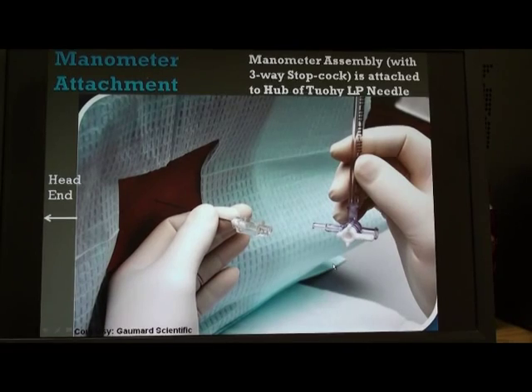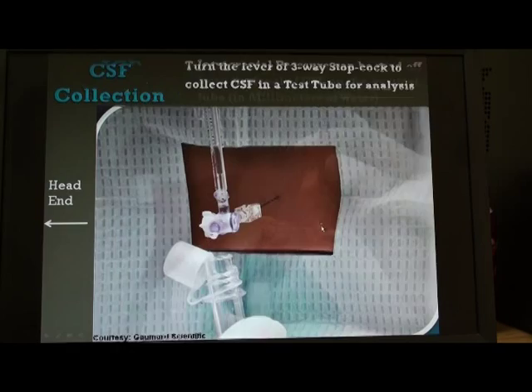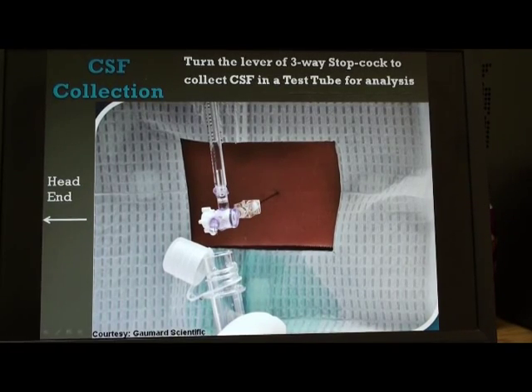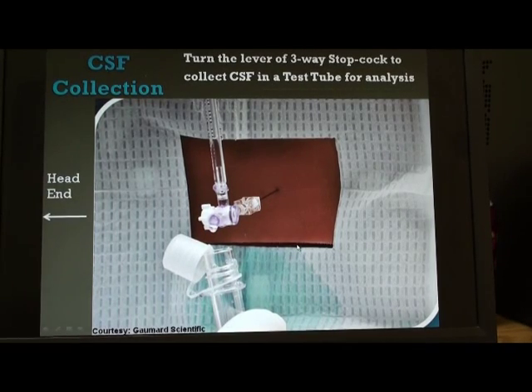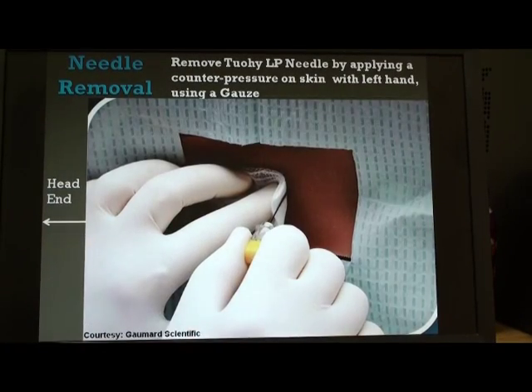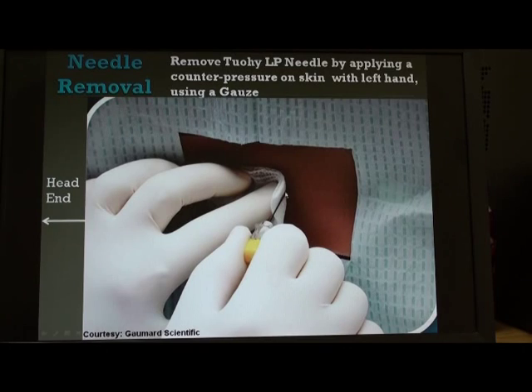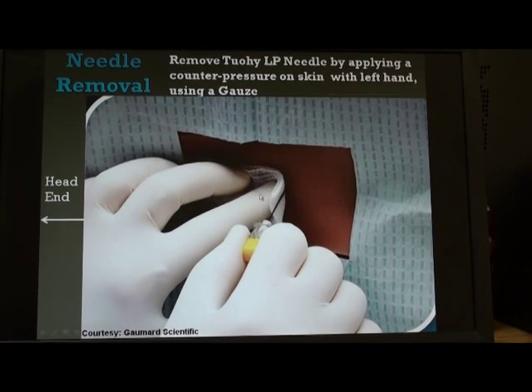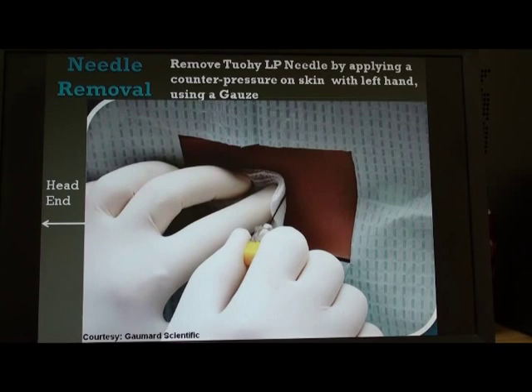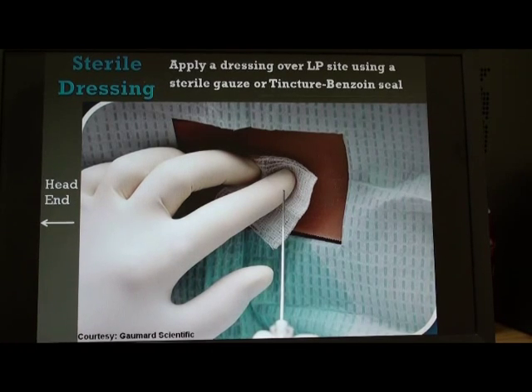Once we have recorded the CSF pressure, the next step is to remove the manometer, turn the three-way stopcock, and place a test tube under the lumbar puncture needle to collect a few drops of CSF for various analyses. After completing all these steps, the final step is to reinsert the stilette into the lumbar puncture needle, pull the needle straight backward while pressing a gauze on the skin with the other hand to provide counter pressure and prevent skin tenting. We then apply a sterile dressing using a tincture benzoin seal to close the procedure.